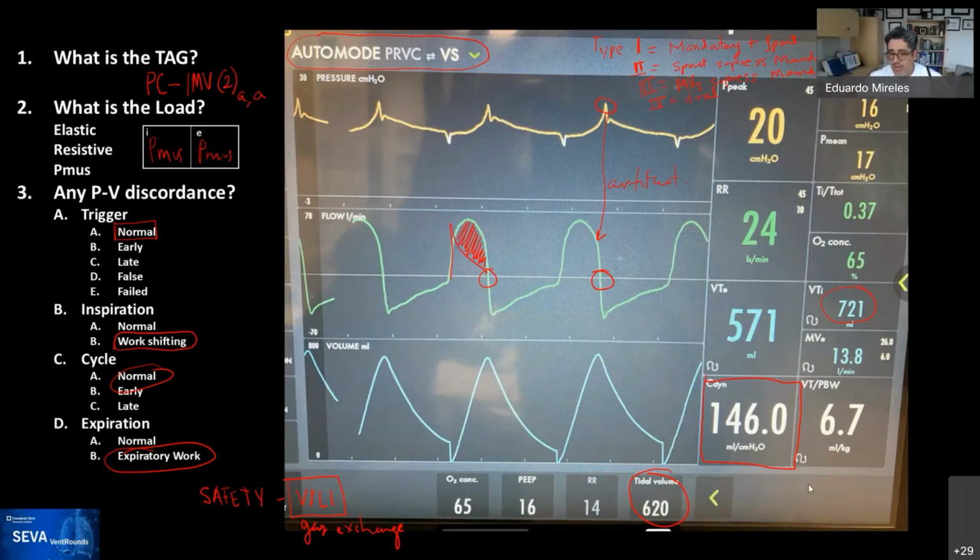Very good. Rob, any concerns, thoughts? Yeah, the problem with APRV is that depending on how you use it, if you set a desired PEEP in APRV, that's one thing. But if you're trying to set PEEP with gas trapping in very short expiratory times, there are two major problems. One is that many ventilators won't let you do it. You think you're setting a short, like 0.5 second expiratory time, but they won't actually do it because they have internal safety overrides, and that destroys the PEEP you think you got in the lungs.